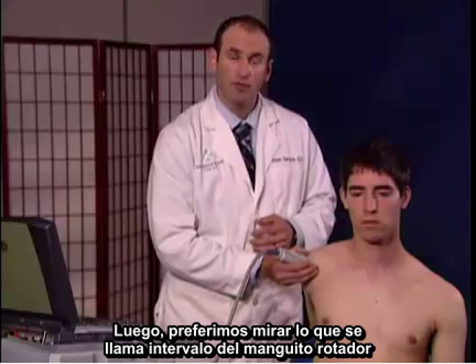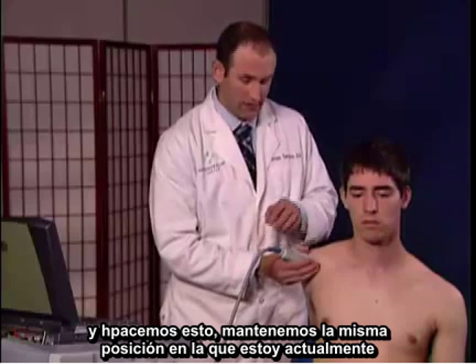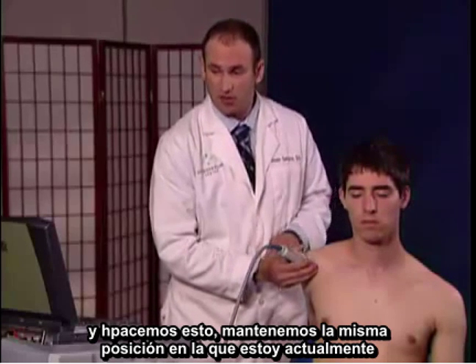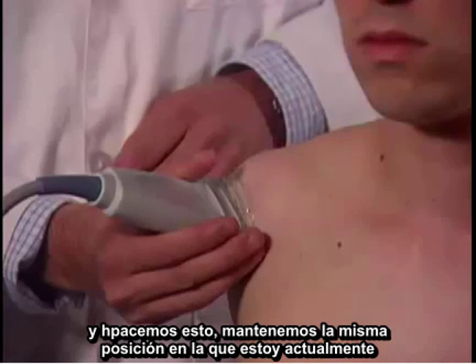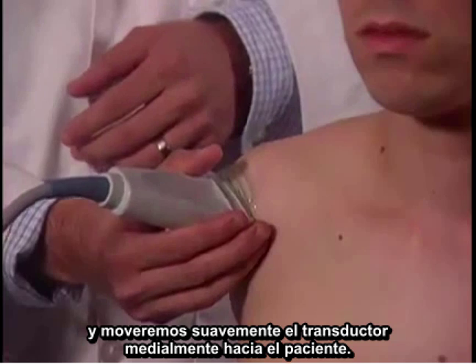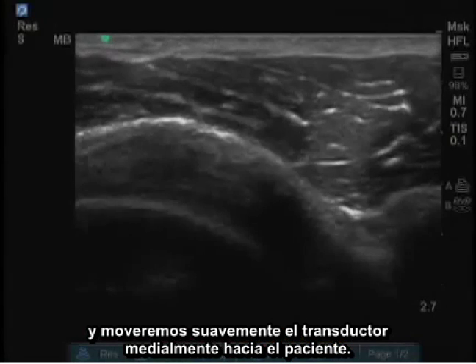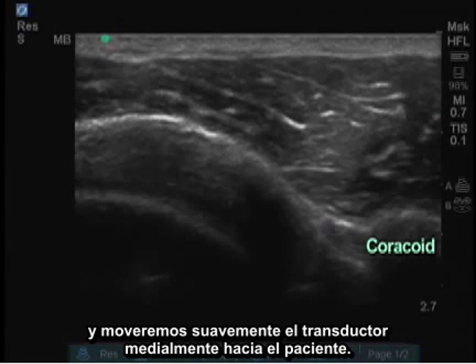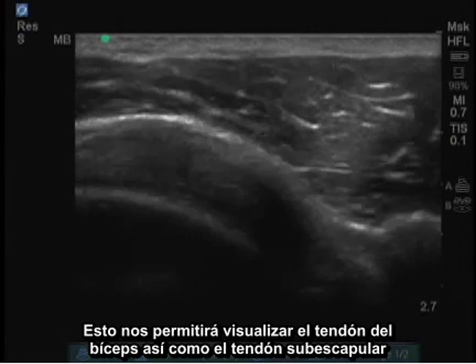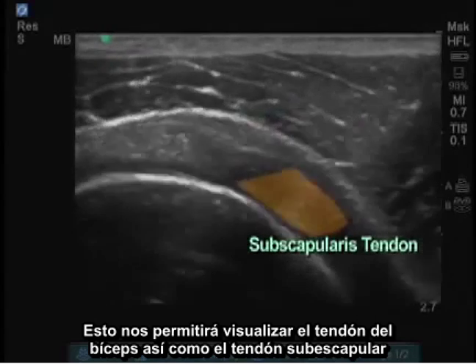Next, I prefer to look at what's called the rotator cuff interval. To do this, I maintain the same position that I'm currently in and I'm going to slowly move the probe medially towards the patient. This will allow me to visualize the bicep tendon as well as the subscapularis tendon.